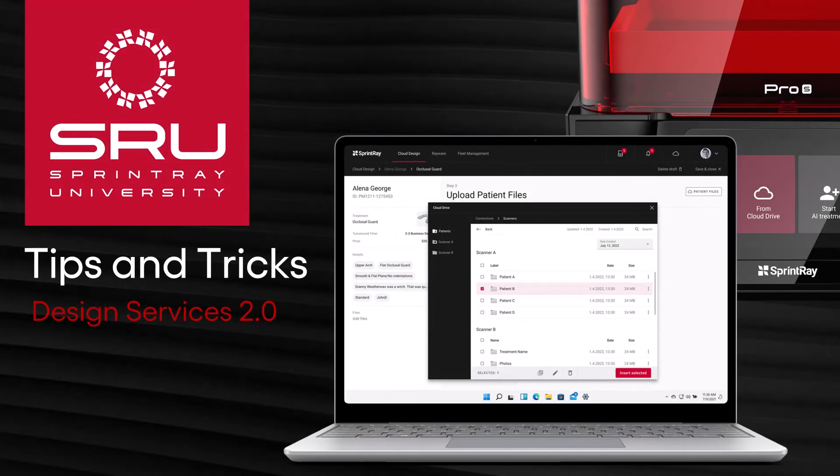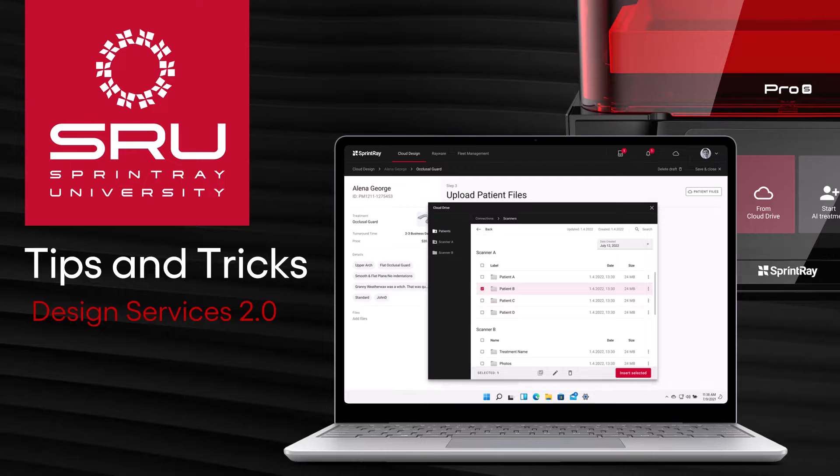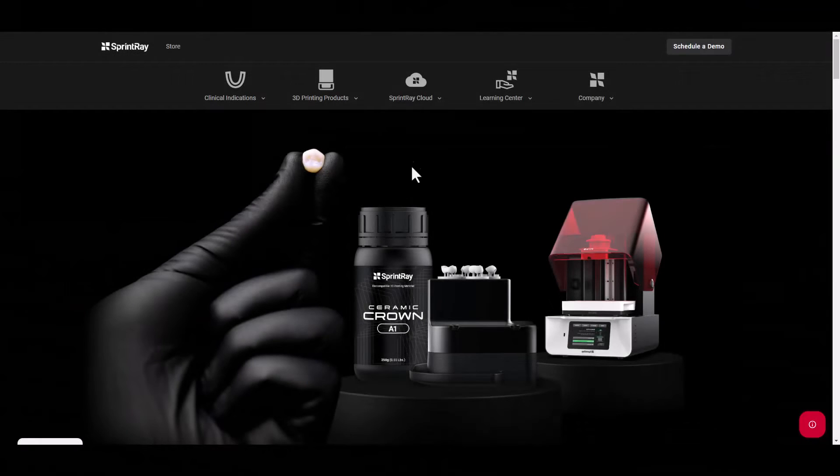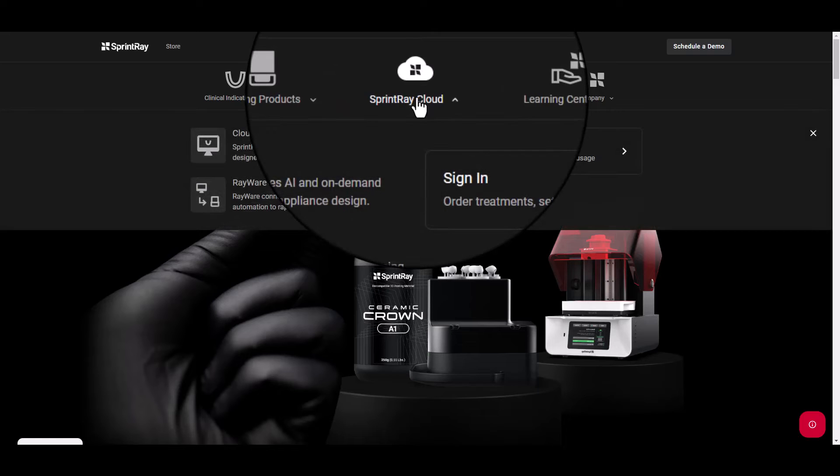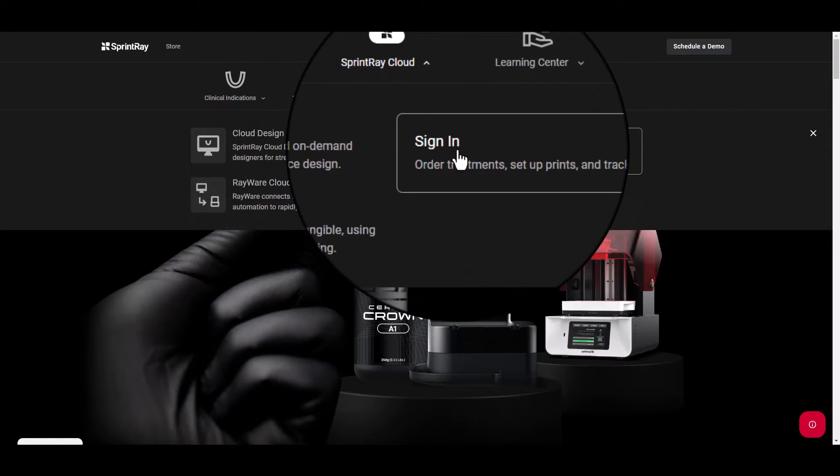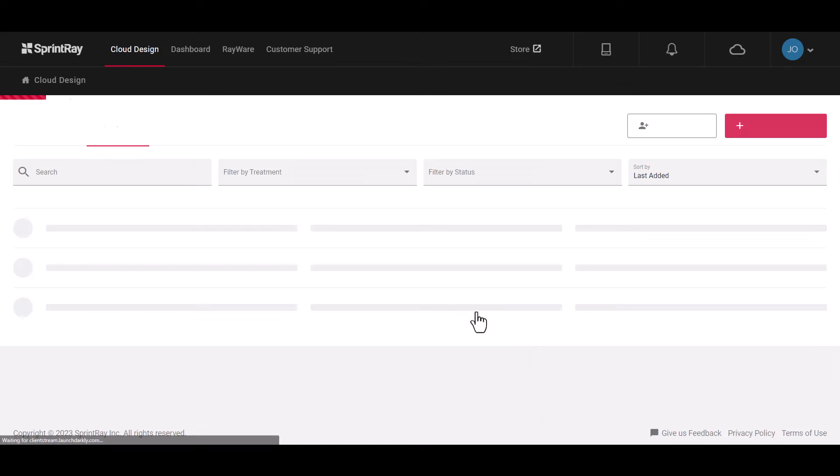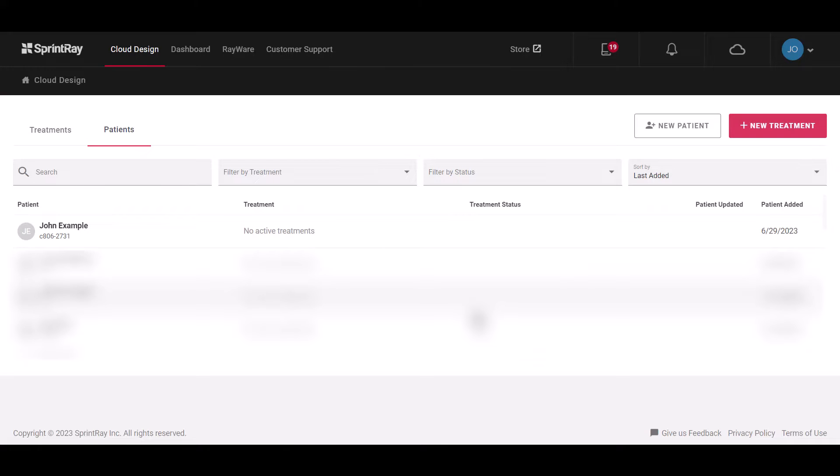Today we will be covering the Design Services 2.0 User Interface Updates. To begin, go to SprintRay.com and log into your SprintRay cloud account or navigate directly to dashboard.sprintray.com.